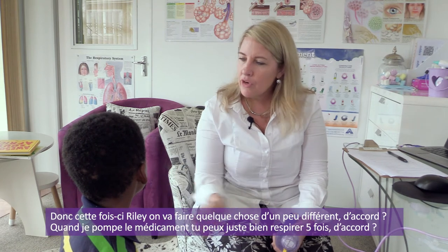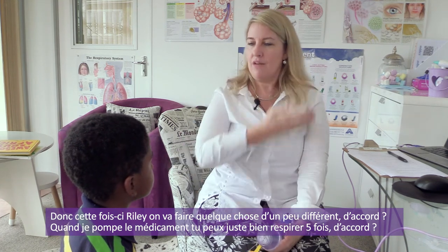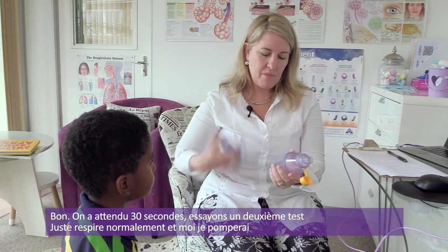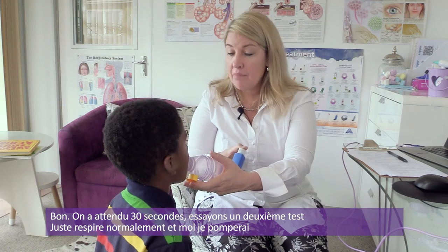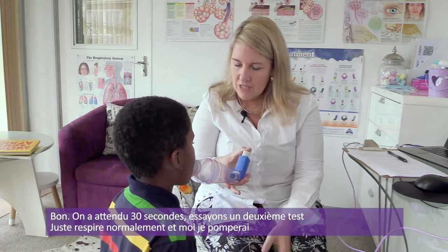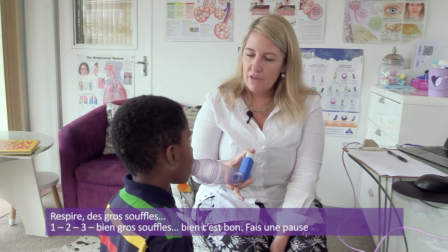So this time, Riley, we're going to do it a little bit different, okay? This time, when I spray it, you can just breathe in big breaths in and out five times. Is that all right? Okay. Right, we've waited 30 seconds. Let's do another one. Okay. Right, okay, are you ready? Breathe in and out, big breaths, big ones. One, go, breathe. Just keep breathing and then I'll spray it, okay? Keep breathing, big ones, in and out. Good boy.